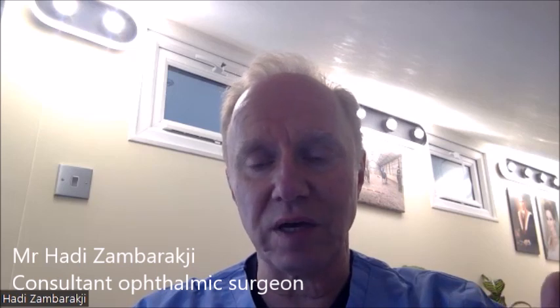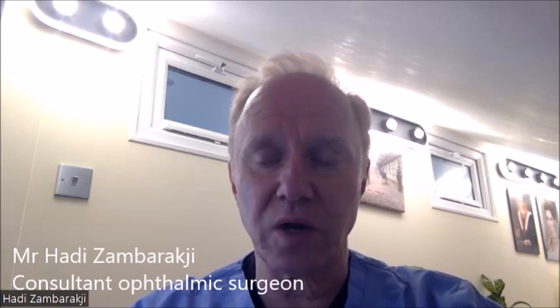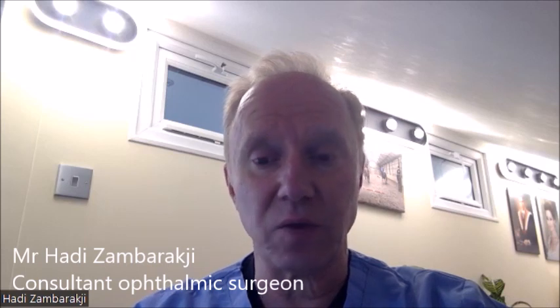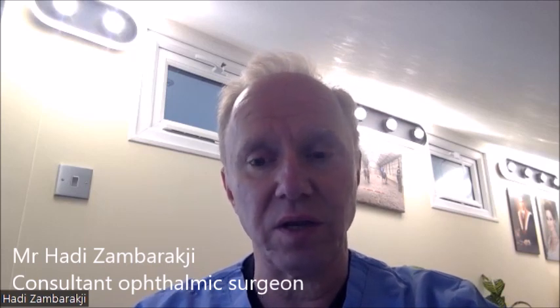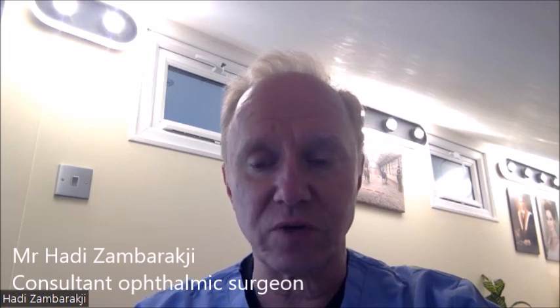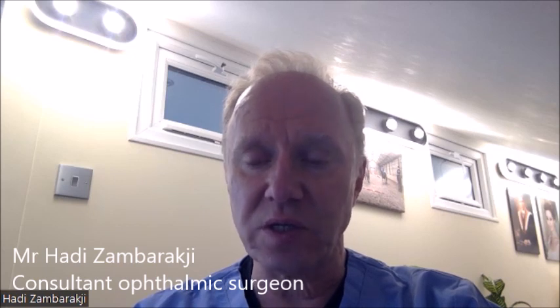In other words, without giving the patient a big difference between the distance eye and the near eye. This is important because some patients will not tolerate a bigger offset. And with enhanced monofocal lenses, you can achieve good reading vision, for example, with a fellow eye without necessarily using a big offset.